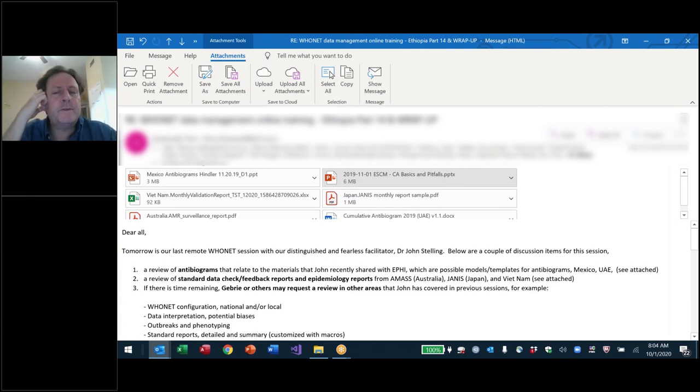And serotyping is extremely valuable for pneumococcus to know if you have the right vaccine. So this is an example where they have the ongoing surveillance with 90 hospitals. They don't have all 90 hospitals do serotyping. There's a subset of the hospitals that are given extra funds and training to do serotyping following more of a protocol. And for these people, they also have some follow-up questions.